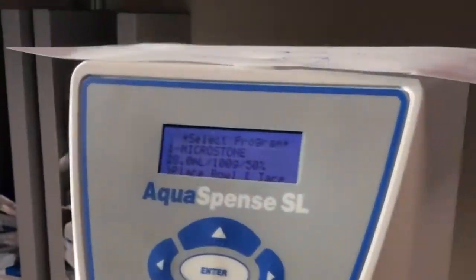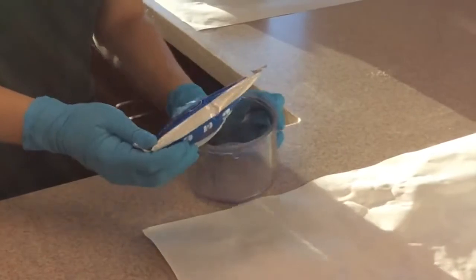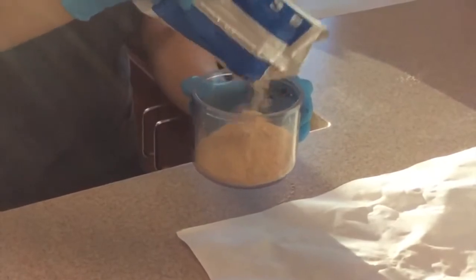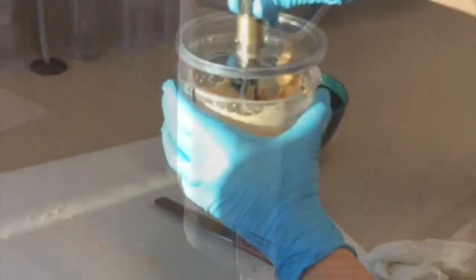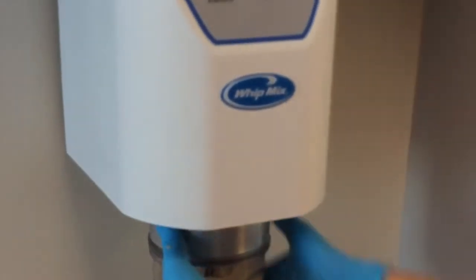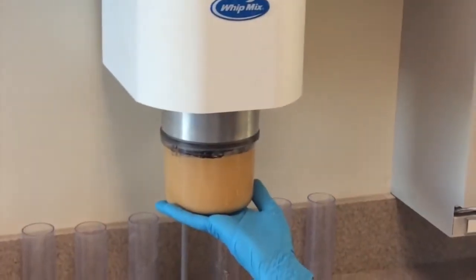This is the aquaspence. Make sure it's set to microstone. Then place your bowl and press tare. Once complete, you can empty a packet of stone into the bowl, place it back on the scale, and press start — this should dispense some water. You'll want to mix the stone and water together with your small spatula first, then place the mixing spatula into the bowl and put it on the vacuum spatulator. This helps to remove air bubbles. You'll want to hold onto the bowl until the paddle starts spinning — otherwise you'll have a very big mess. Once it's complete, it will beep.